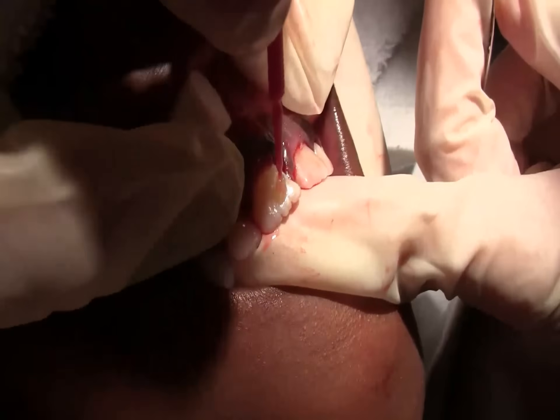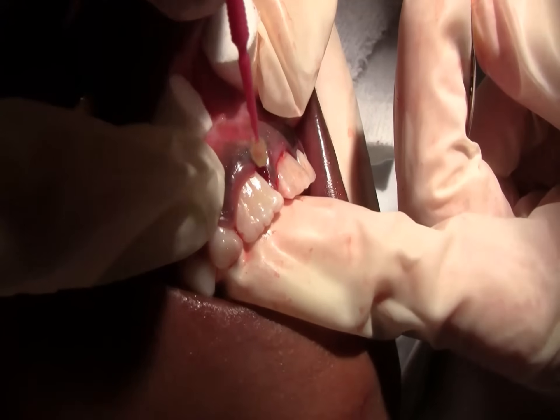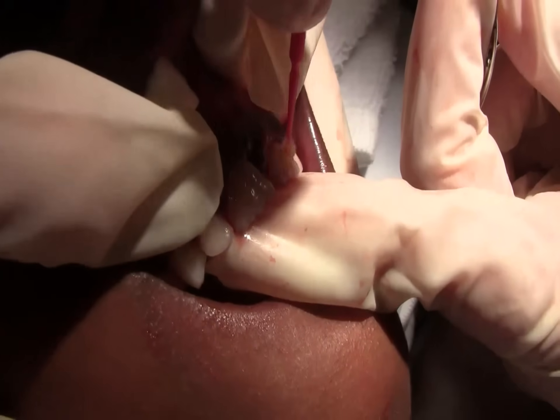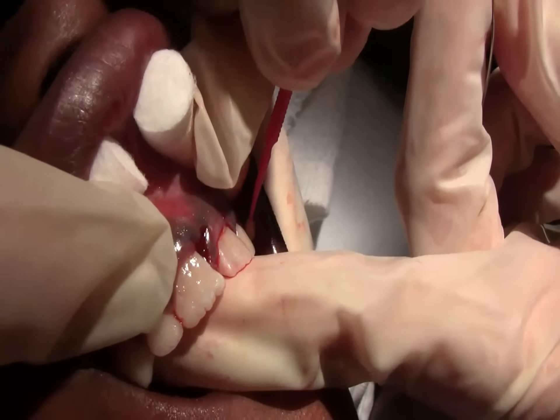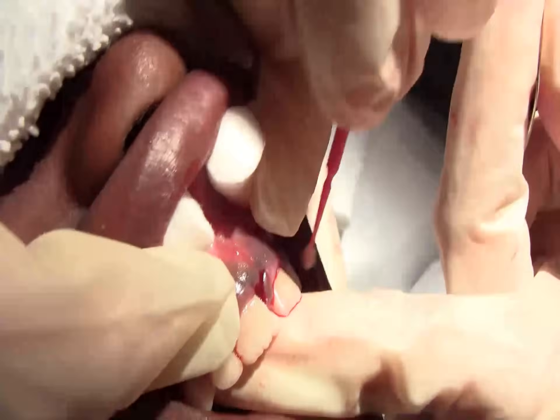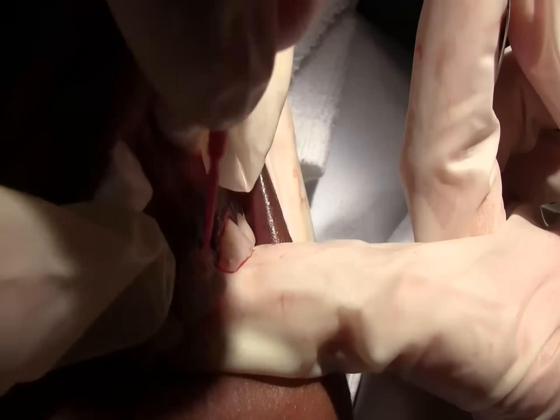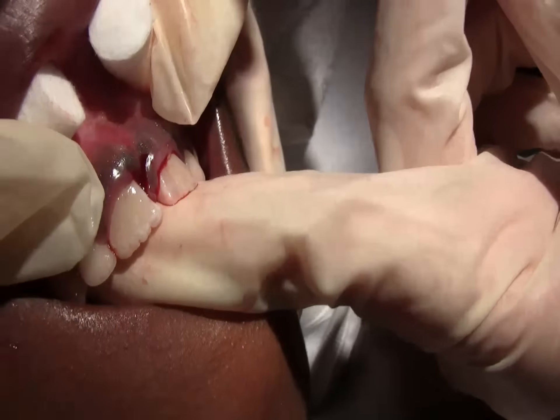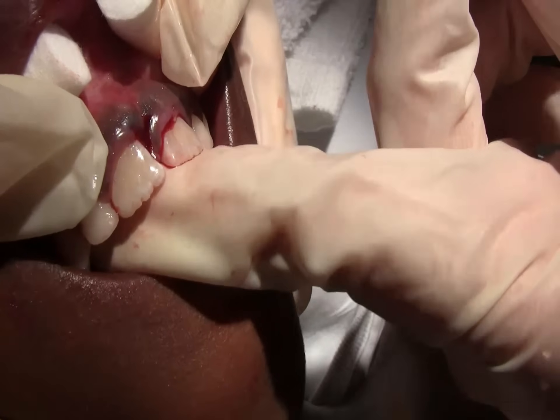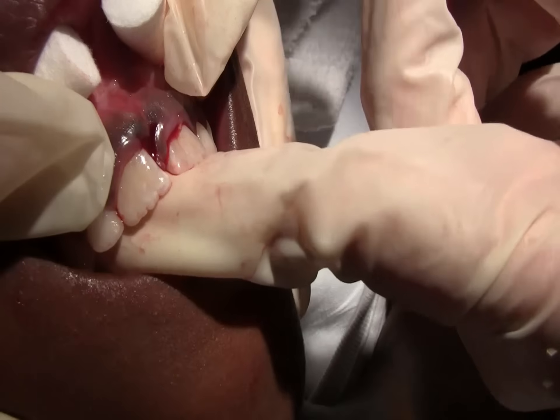Keep in mind, you want to really use this and keep it as dry. Open a little bit bigger for me. There you go, because we're trying to keep those teeth dry. I know this is difficult. You're gonna have to hold somebody's hand for a minute, okay? I'm actually gonna use an extra step in here just to make sure we have plenty of retention.